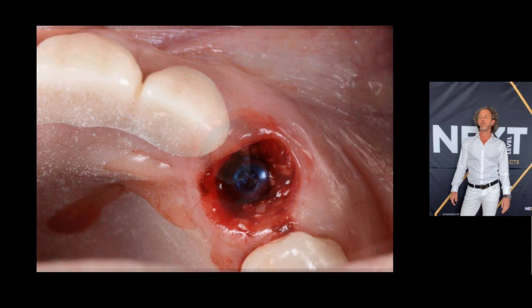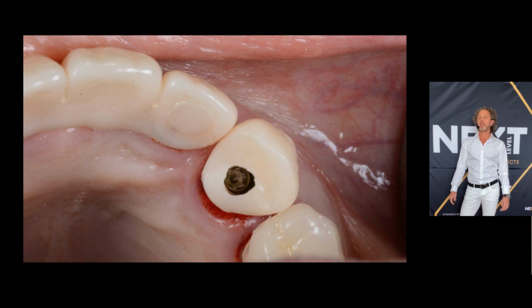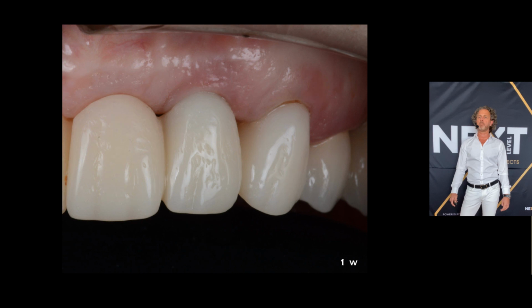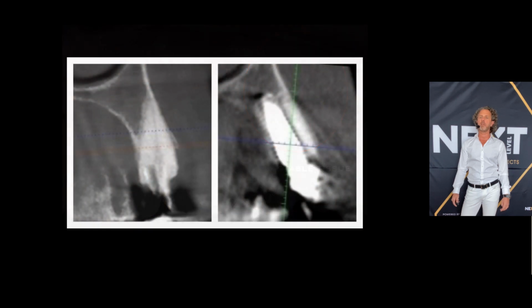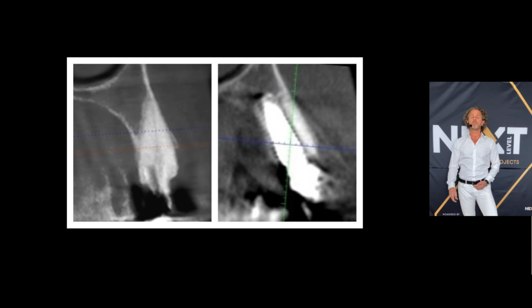Measure the ISQ, made the bone filler material GBR, immediate chairside temporary. This is the profile, and 1 week follow-up. Look at this, how stable the tissue is. Look at that. And on the CBCT, the shield is clearly visible.